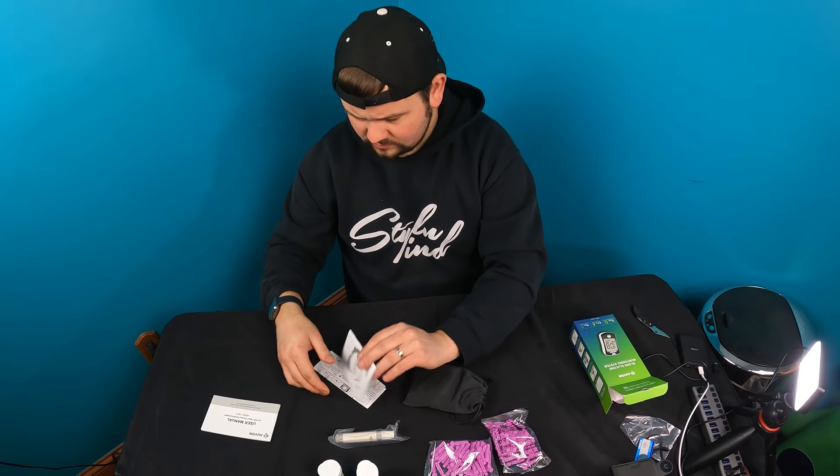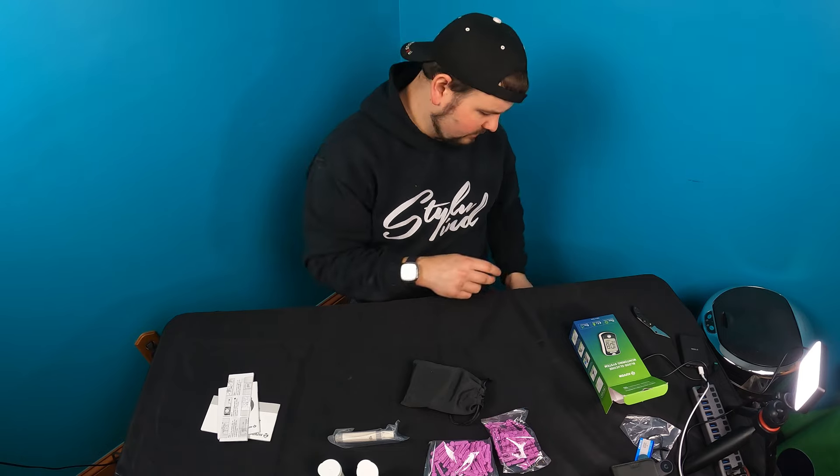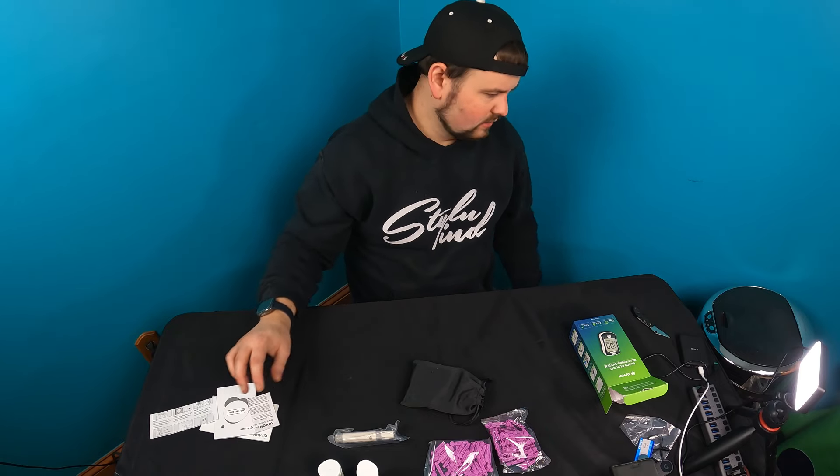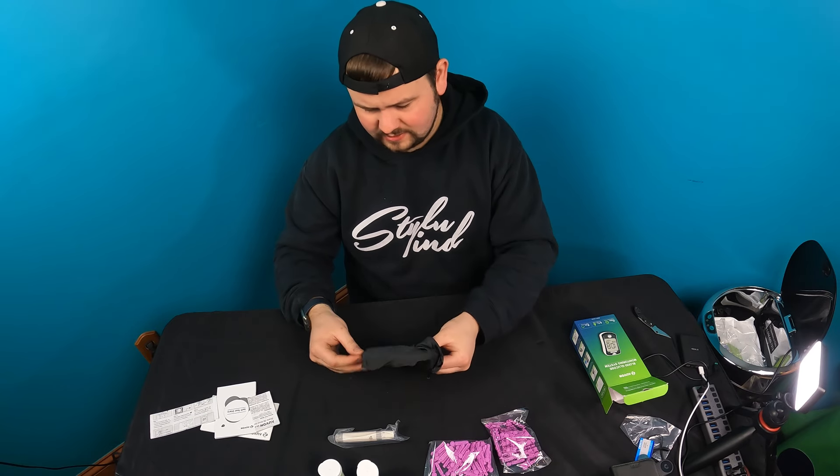They give you the manual and self-testing instructions, so everything is included in there, along with a warranty card. Let's see what else they provide inside this bag.